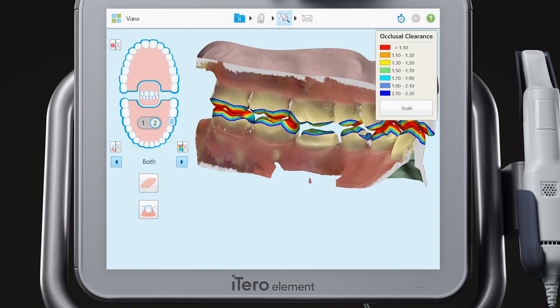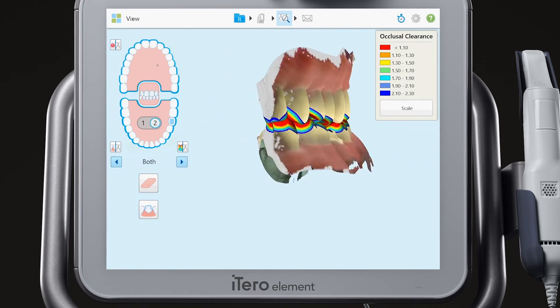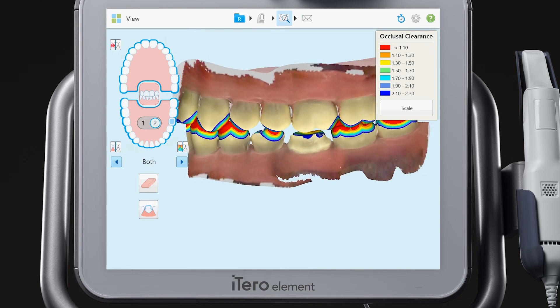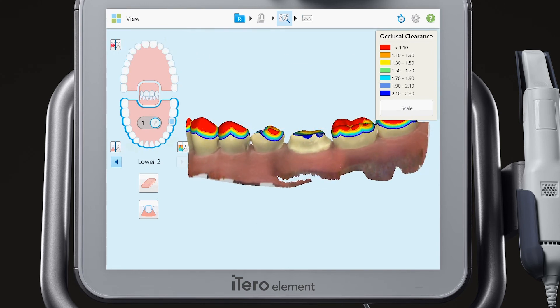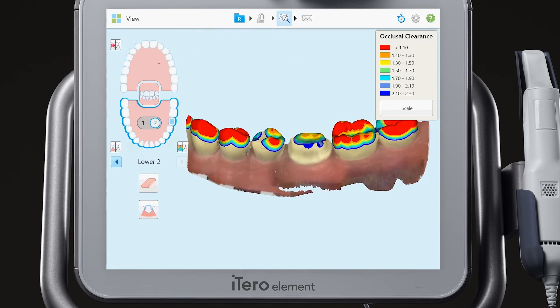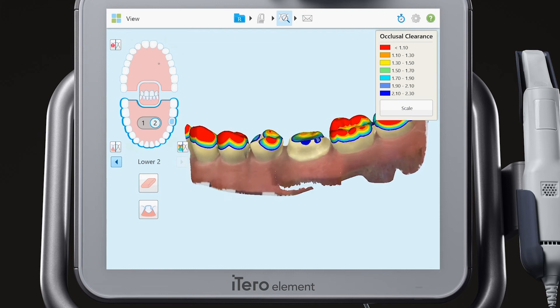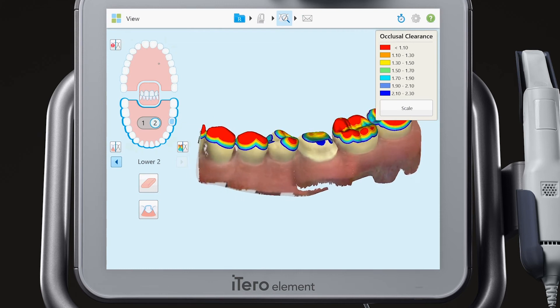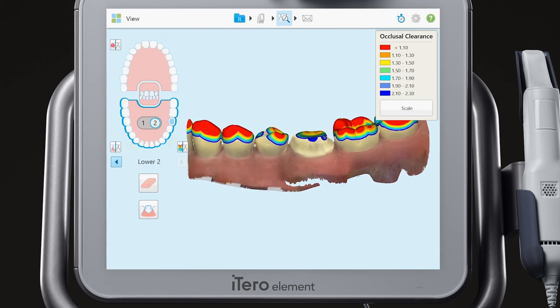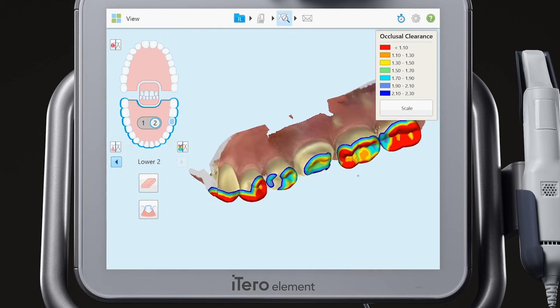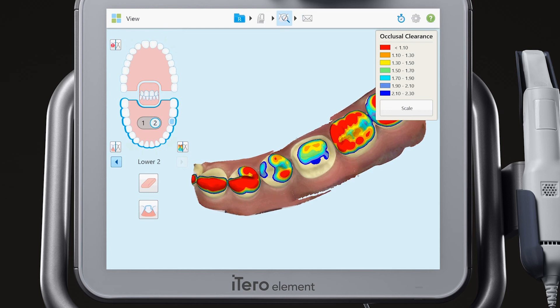Add the opposing arch and rotate the model to view the bite relationship. Turn off the opposing arch and rotate the model to ensure the complete capture of the adjacent contacts as well as a margin free from tissue and moisture.